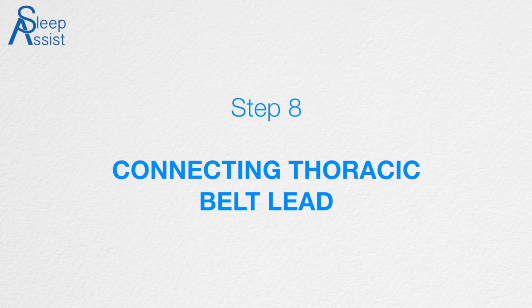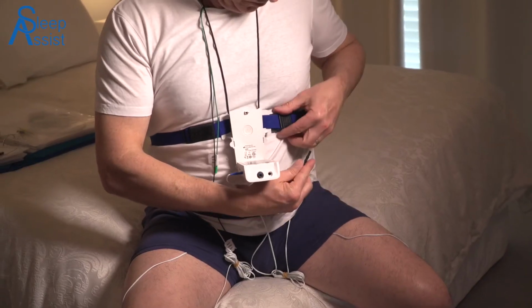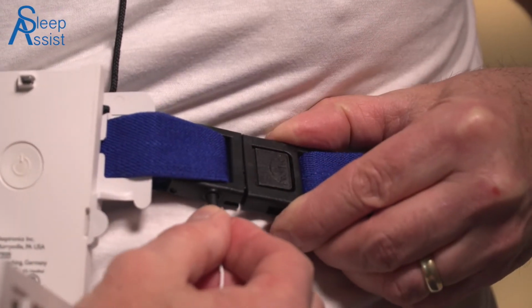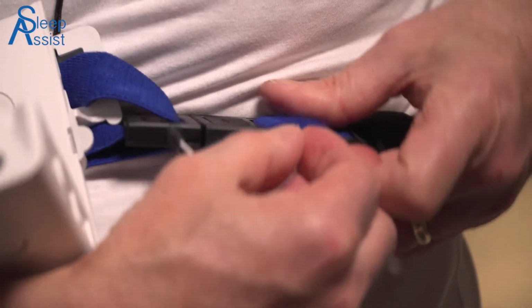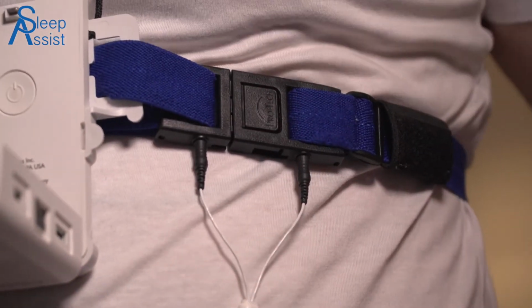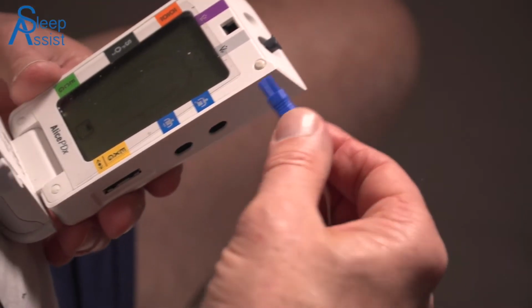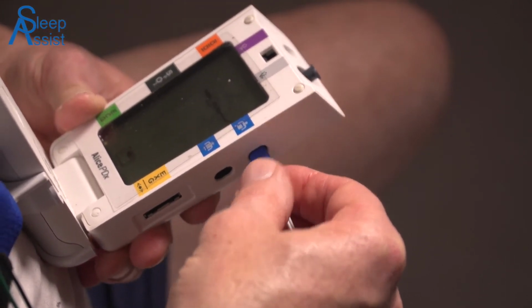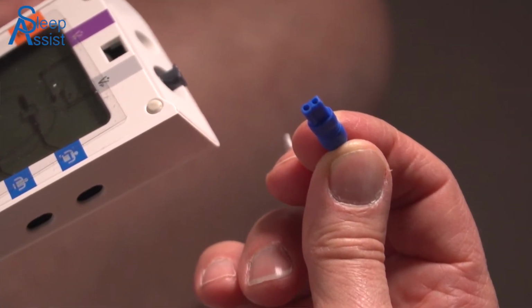Step 8. Connecting thoracic belt lead. The white lead marked thoracic chest belt. Connect the two black plugs into the female ports on the belt clip as shown. Connect the blue plug of the thoracic chest belt into the PDX as shown. Look carefully as one side is flat and the other round, which correlate with the female connection point on the unit.